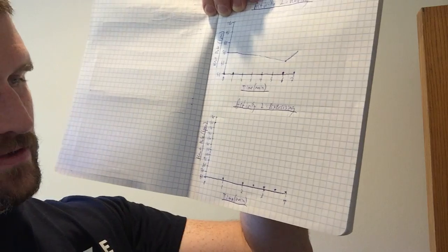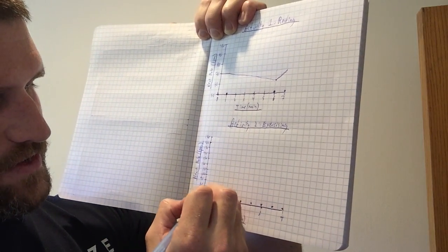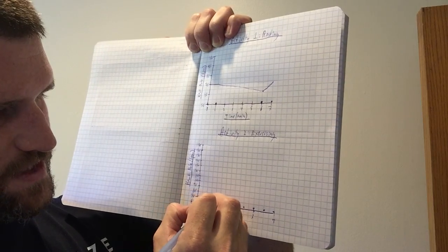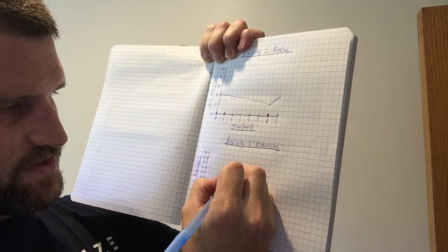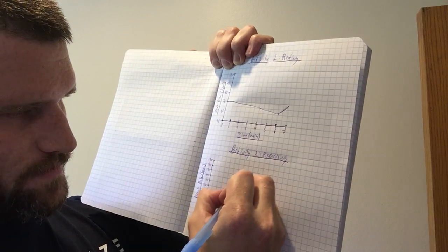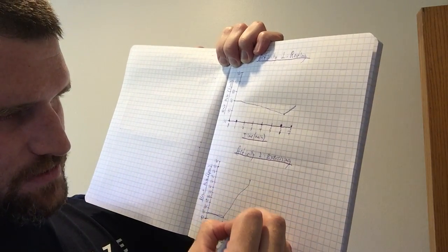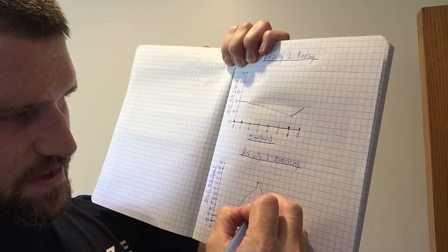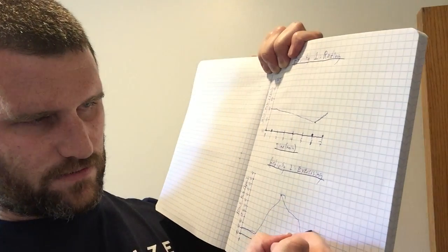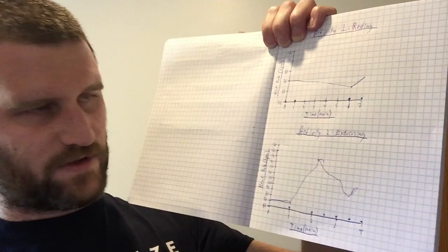For the exercising, it's going to look a little different. Again, you're going to draw a flat line for your sitting position. Again, I was probably around 70 or so for sitting. And then after 2 minutes of exercise, you should see a huge jump. I think I jumped to about 156. Whoop, like that. And then just take your measurements every 30 seconds. You should see a rough kind of drop. Might even spike up towards the end. I actually raised up a little bit towards the end, but you should have more of a pyramid structure on that one.